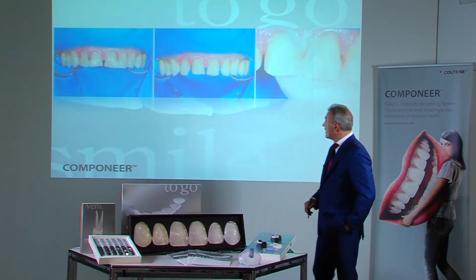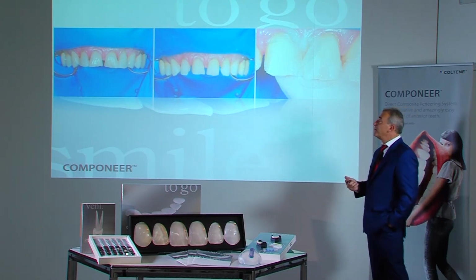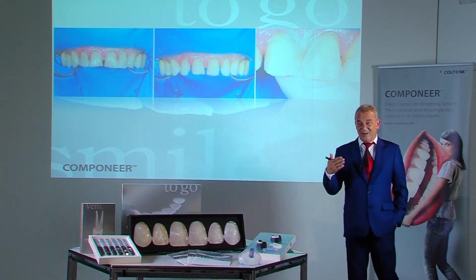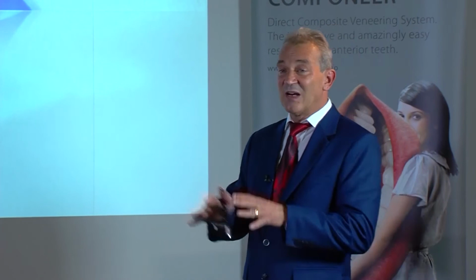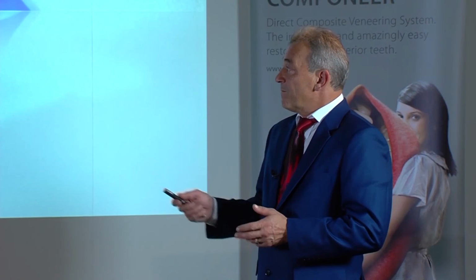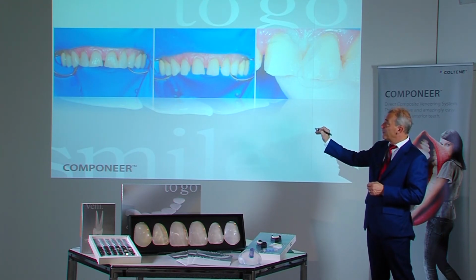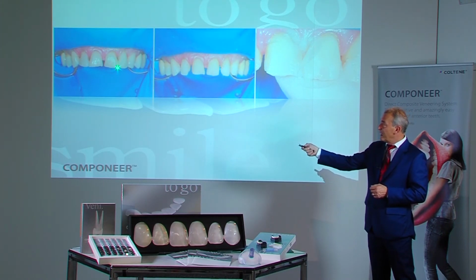Preparation proved necessary, although we only see natural abrasion, and this led to a loss in hard tooth substance. But the patient not only wanted to have the lost substance replaced, but also wanted aesthetic correction of the teeth. Two factors play a role here. If the diastema is only located in the middle, then it is recommended to remove a small amount distally, especially in the case of such trapeze-shaped anterior teeth.